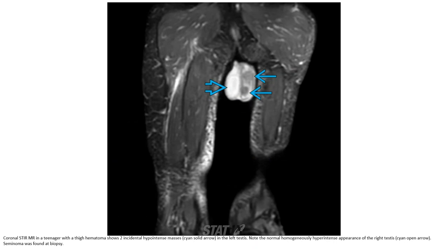MRI in a teenager with a thigh hematoma shows two ill-defined hypointense lesions in the left testis. Note the more homogeneously hyperintense appearance of the normal right testis. Seminoma was confirmed at biopsy.